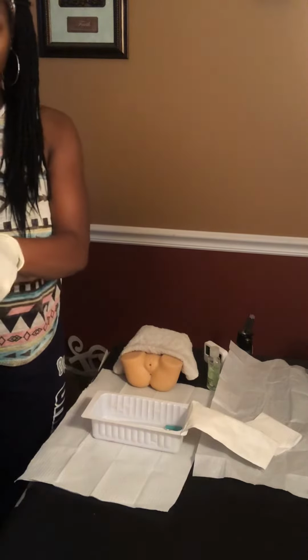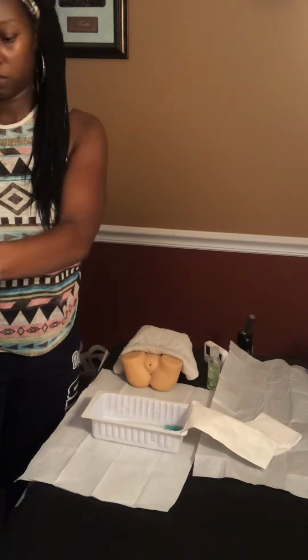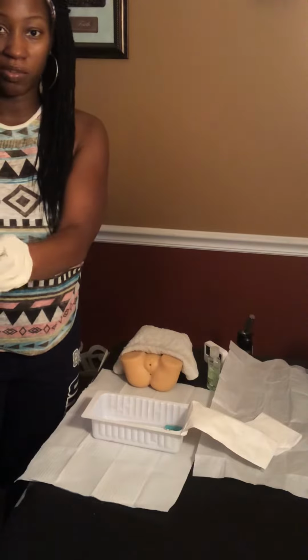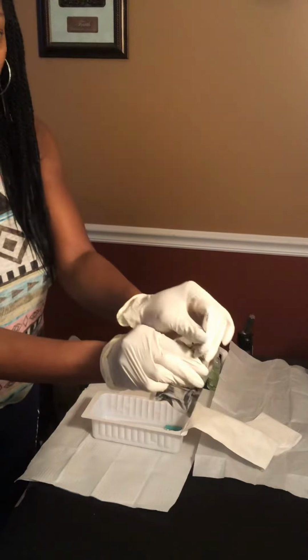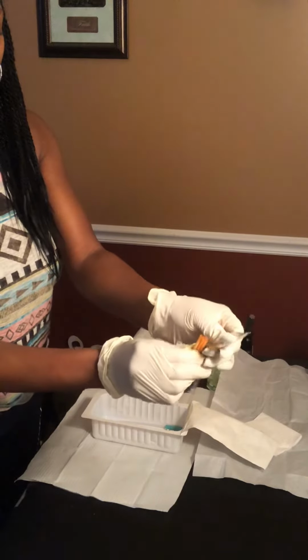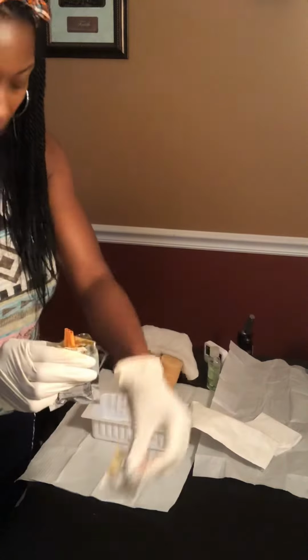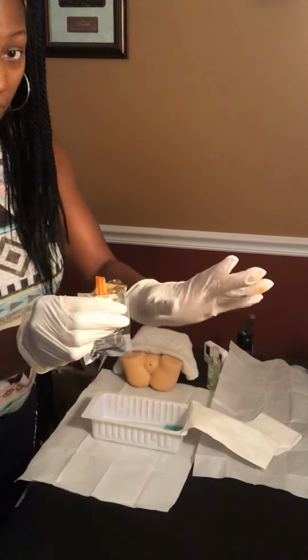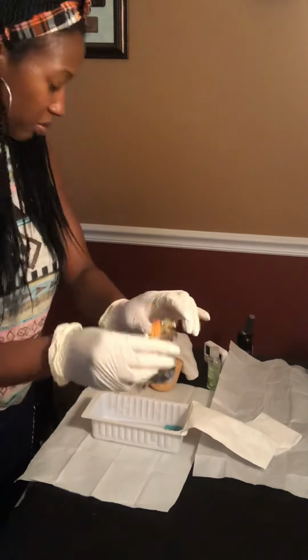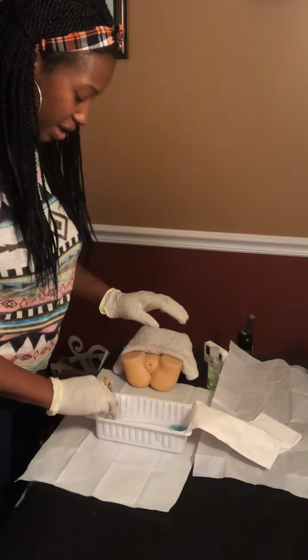I'm taking it from over the sterile field. Be careful because this stuff can splash, so be careful when opening this. Throw that away. Just drop it in there because you want to keep your arms above your waist. Put that to the side.